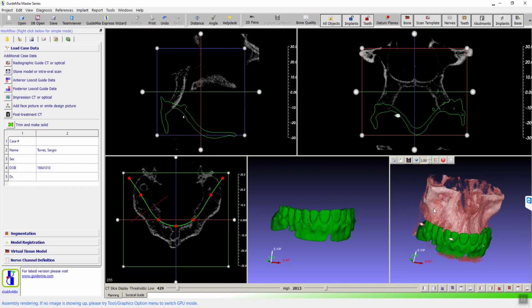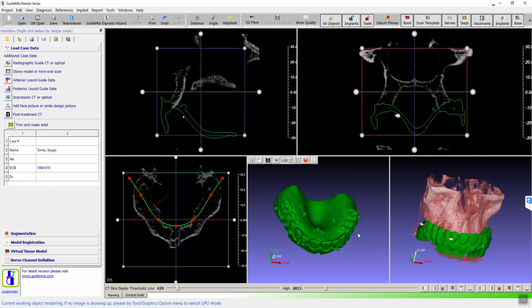Frank, we have a question. Yes. The symmetry you're talking about, is it the palatal and buccal markers on the same plane? Is that the issue? The left side and right side are about the same. So you have one here, one here. So they are symmetric to the center line.